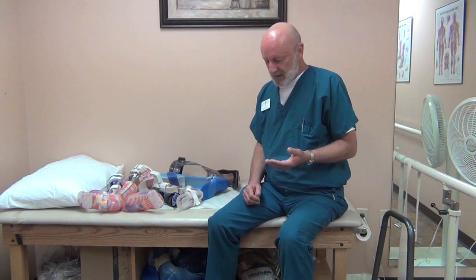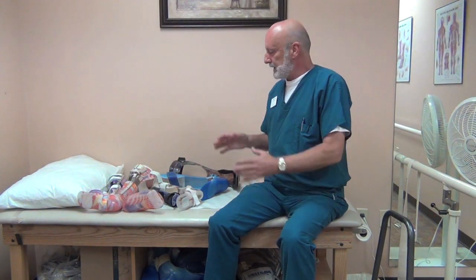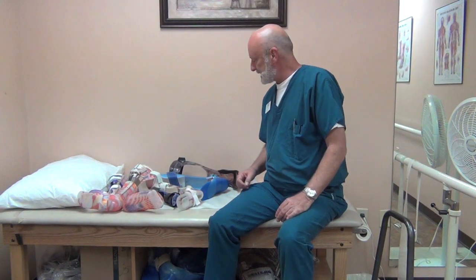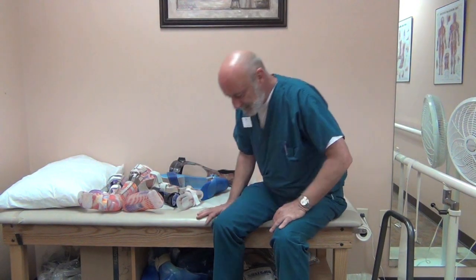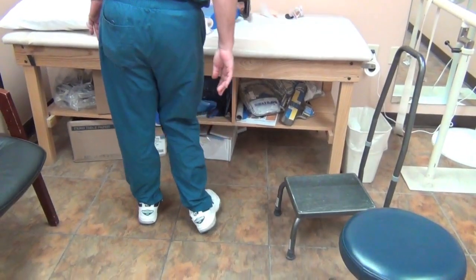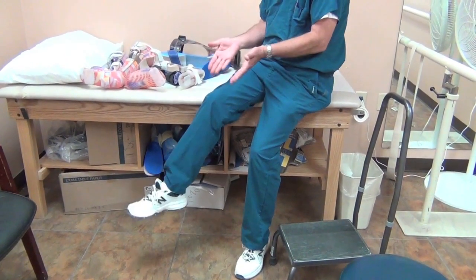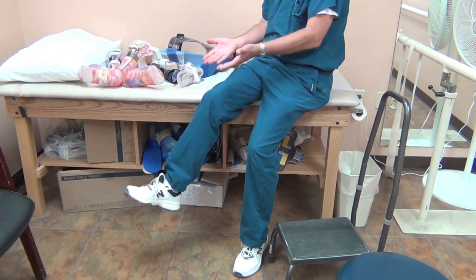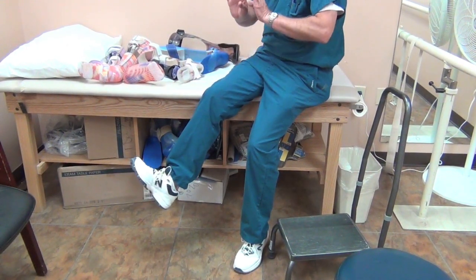When it comes to AFOs — ankle foot orthoses — meaning you have deficits affecting ankle motion and strength, there are a myriad of designs. Basically, you design the brace based on the deficit. We're talking about medial-lateral or side-to-side instabilities, and also dorsiflexion and plantar flexion. Dorsiflexion is the motion of the foot and toes coming up; plantar flexion is the toes going down or pushing off.